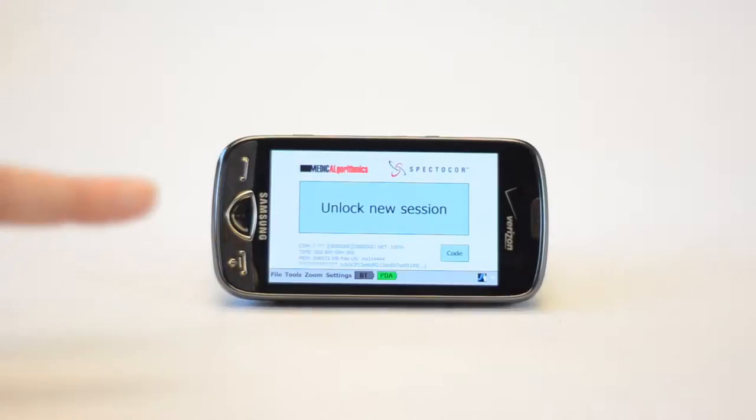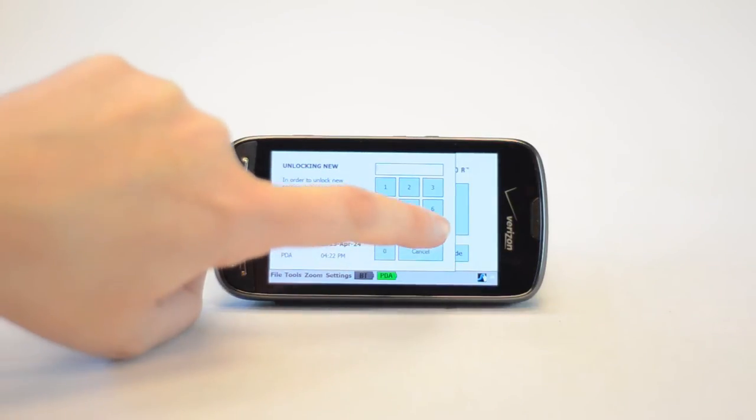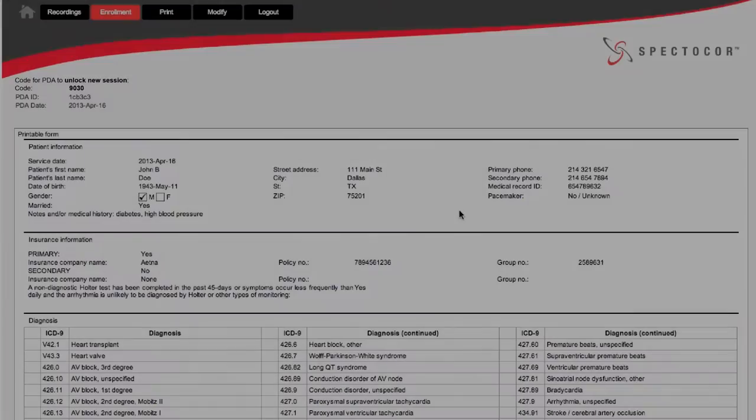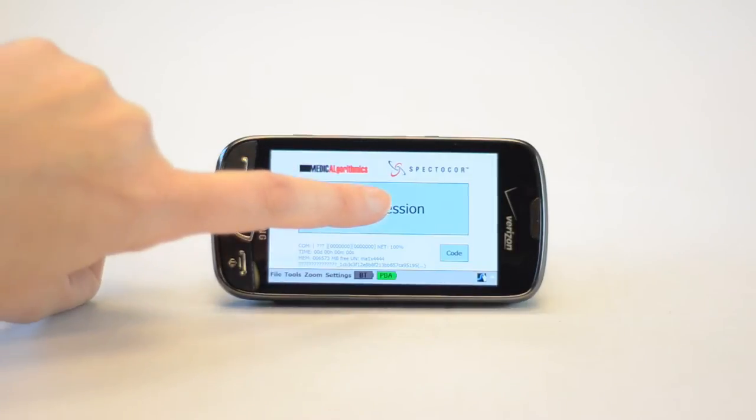To begin this study, press Unlock New Session, then enter the unlock code. The unlock code can be found on the completed enrollment form, or you may call the monitoring center. And now press Start Session.